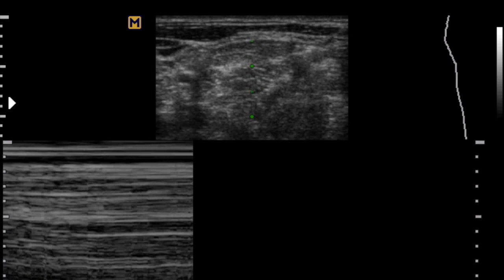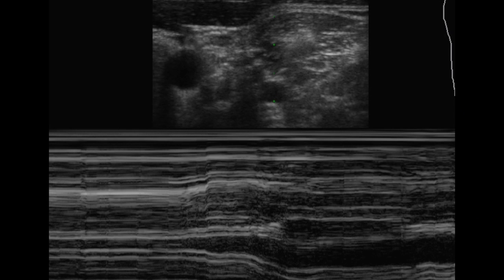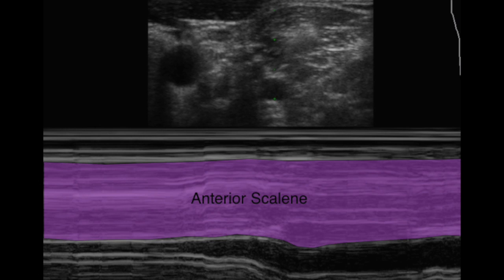The anterior scalene can then be imaged in M-mode to assess any overactivity in the muscle during the contraction of the deep cervical neck flexors. Ultrasound can then be used as a biofeedback tool to inhibit dysfunctional activity.